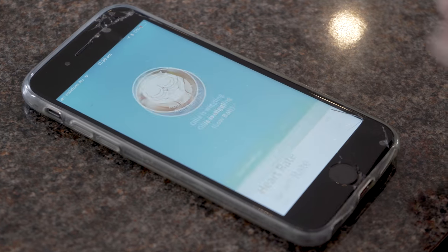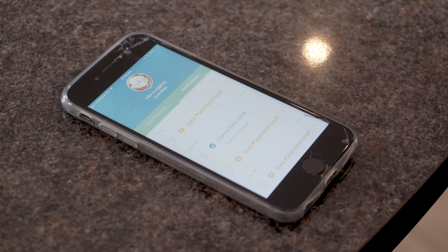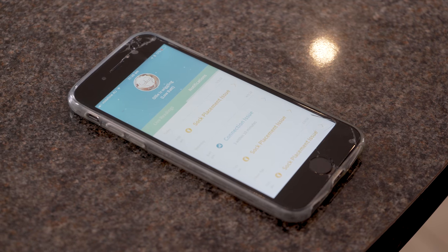Yeah, you can track what's been happening, see the different trends, see what the average heart rates and oxygen levels are, and it tells you when he's been sleeping as well — so it's really handy.